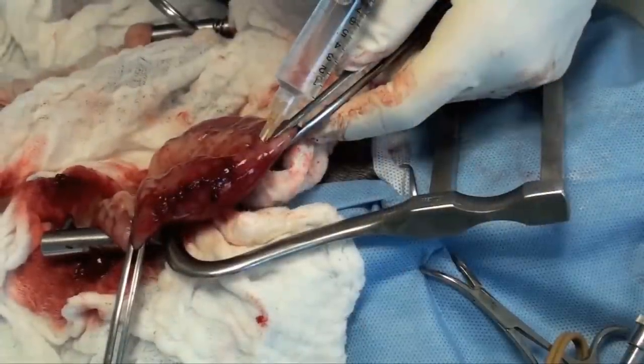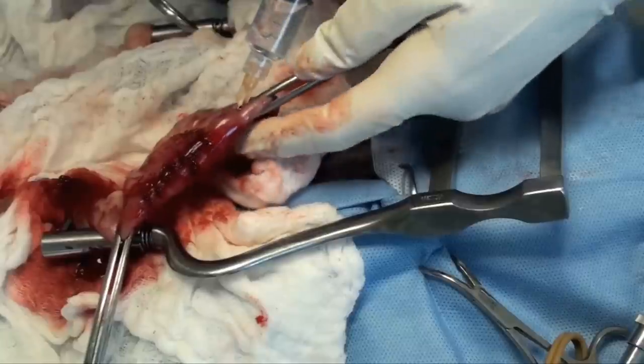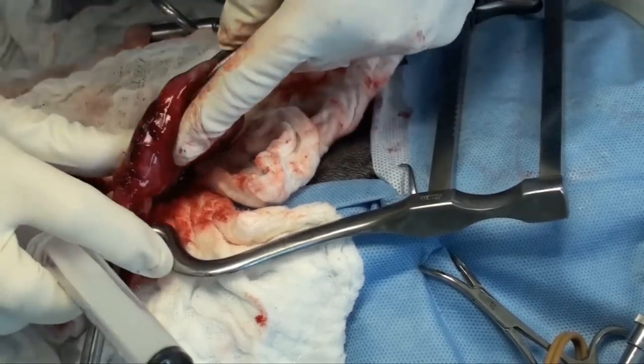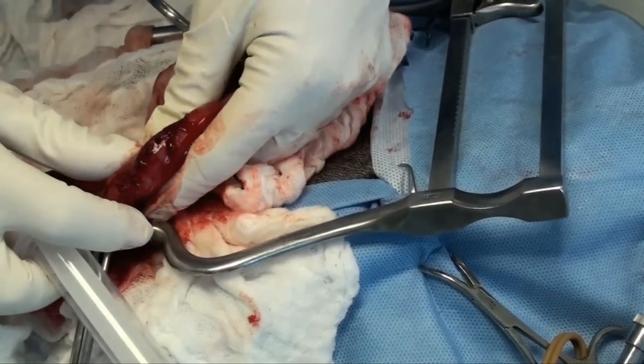Once I'm done closing the bowel, I'm going to leak test my closure to make sure that it is properly done. I still have my doyens in place. I'm going to use about a 10 to 20 cc syringe filled with saline — a 22 or 23 gauge needle works best. Bring the doyens in closer so you don't need a lot of saline. You want to see some distension of the bowel; I'll push making sure the bowel is turgid enough, and as I push I should not see any saline come flowing through the enterotomy line. If I do, I know I need to put another stitch to correct that spot. I will retest if I've had to redo part of the suturing.